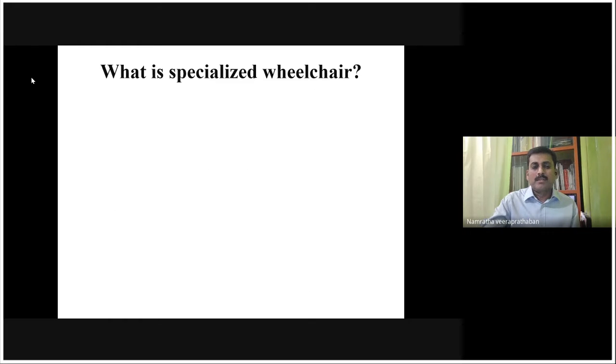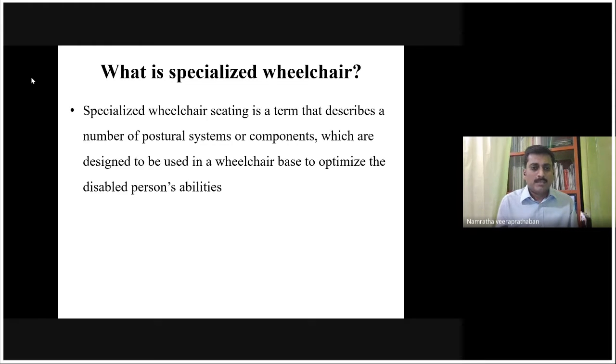Next is, what is a specialized wheelchair? If you know the definition of a wheelchair, then we're supposed to know what a specialized wheelchair is. This is how the webinar is for today. Specialized wheelchair seating is a term that describes a number of postural components or postural accessories, which are specially designed to be used in a wheelchair base, to provide and optimize the disabled person's abilities or skills to better perform in their own environment. So this is what the specialized wheelchair is all about.